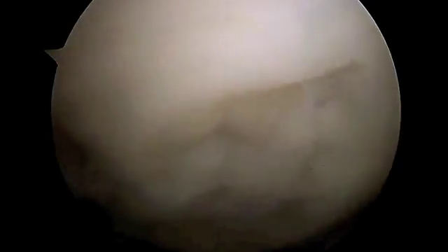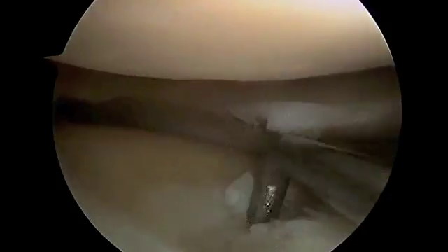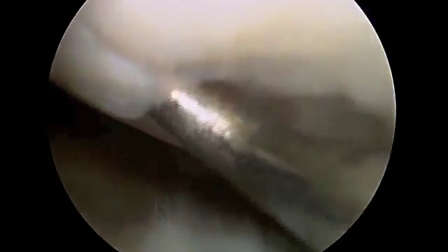You can see this femoral condyle has a defect — there's an articular surface defect there. Now we've moved over to the lateral side of the knee. Again, you can see on the tibial plateau here there is unstable articular cartilage — not a huge area, but definitely some wear. And here on the lateral femoral condyle, there's also a little bit of a defect with a loose band of articular cartilage.